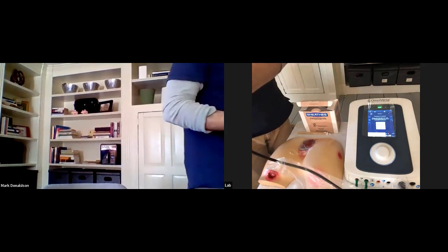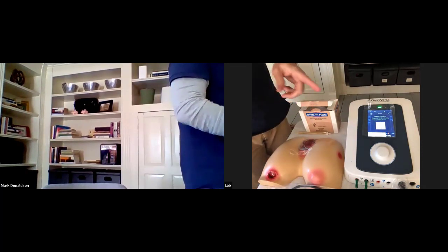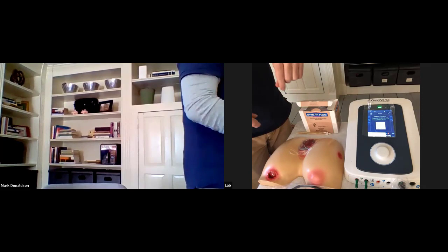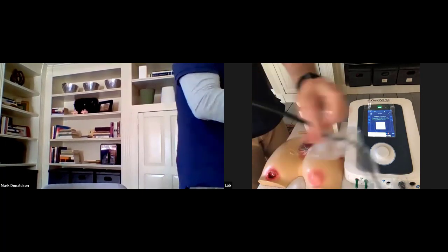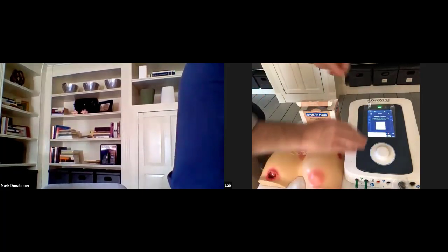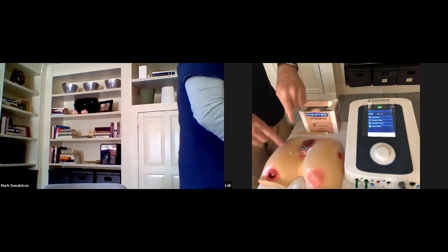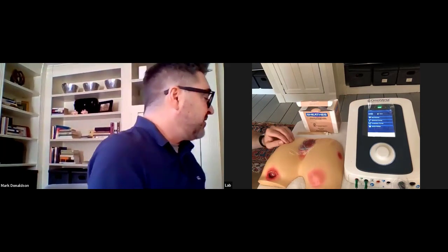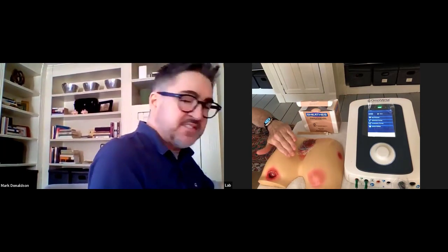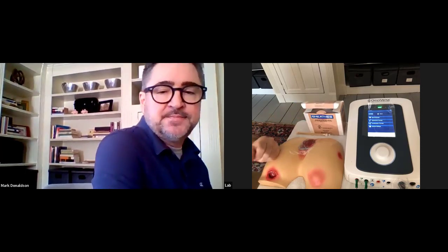With gloved hands, all infection control items come off. We would clean everything very well with an approved super-sani cloth — not the resident, but the transducer. Once the cord covers come off, the whole cord, lead wires, screen, and the whole unit would need to be treated. The more difficult part is that now we've done a lot with this wound — if this is not the typical wound dressing this resident would have, all of this has to come off. We'd remove some of the layers and ask nursing to come in to provide the correct wound dressing on top. Mark, thank you again for a wonderful presentation.